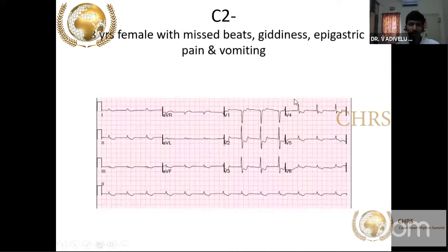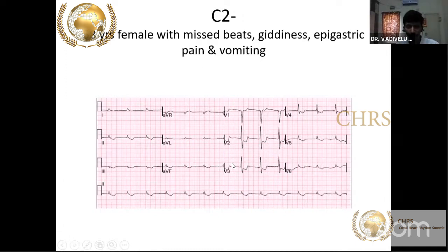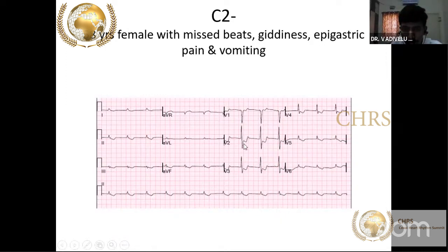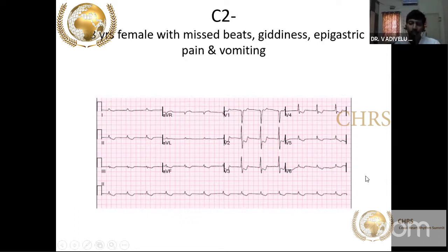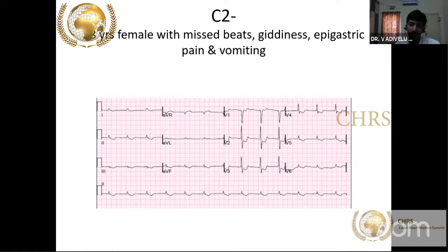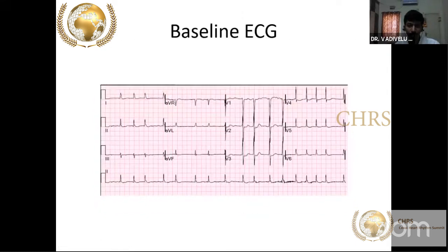A 58-year-old female on digoxin for valvular heart disease presenting with frequent missed beats, giddiness, epigastric pain, and vomiting. ECG shows junctional rhythm with good ST segment depression — a reverse tick sign with T wave overshoot. This is very classical of digitalis effect. Digitalis toxicity occurs when there are arrhythmias like AV blocks or increased automatic ectopic junctional tachycardia.